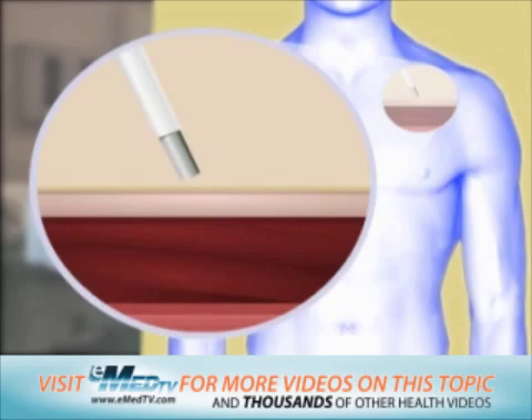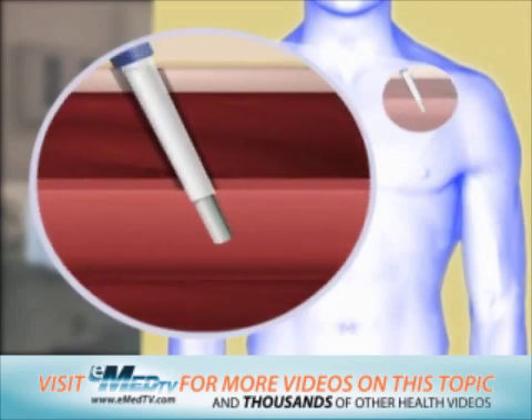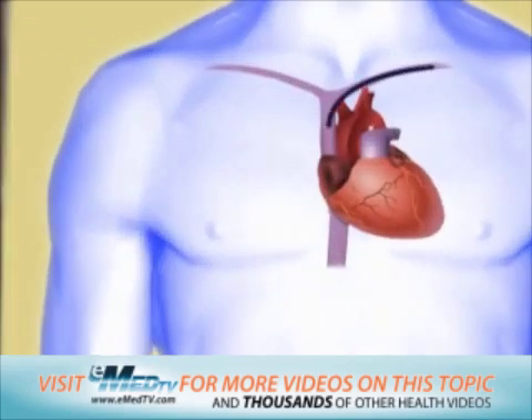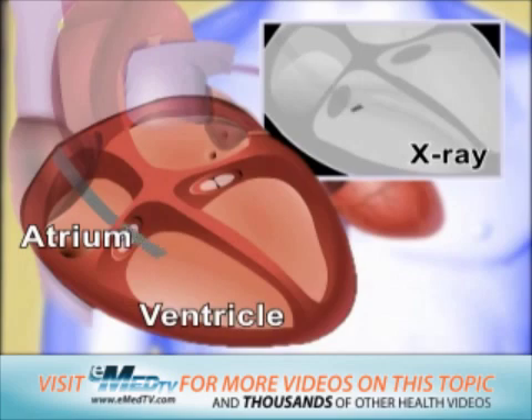Once the area is numb, a needle is used to guide an introducer into the vein. The doctor then puts one lead wire through the introducer and will most commonly guide it into the heart's ventricle using a special X-ray screen.